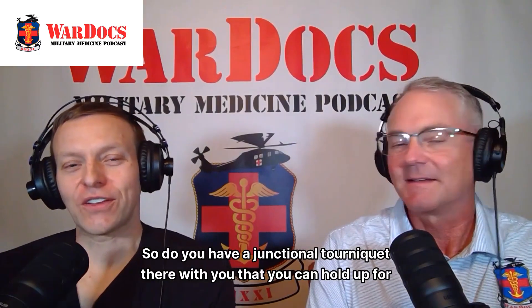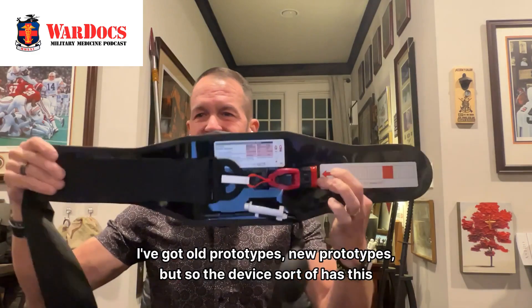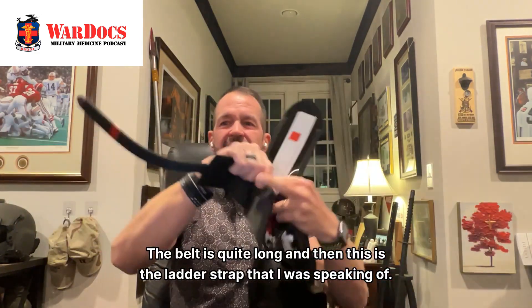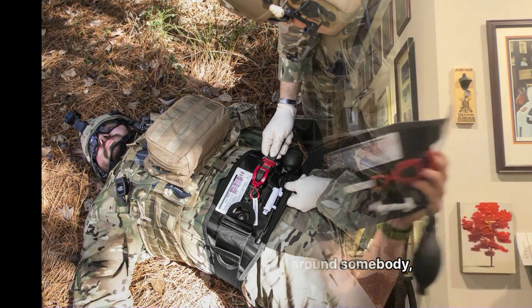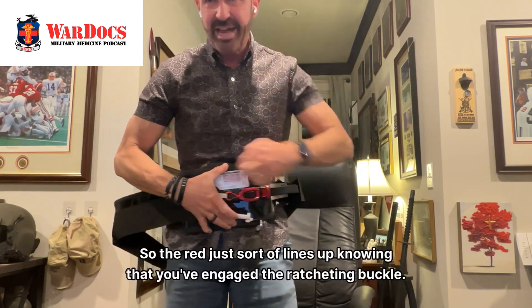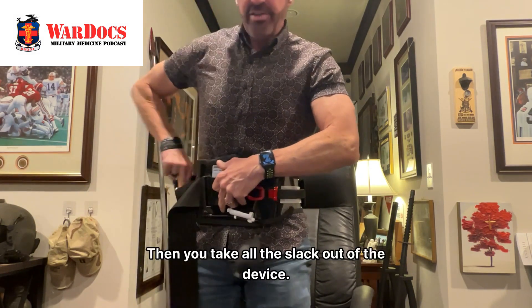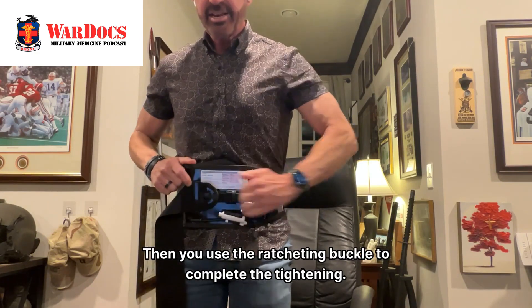The device has a cumberbund shape and the belt is quite long. This is the ladder strap, and when it's strapped around somebody — I'm just going to put it on real quick so you can see how this works. Red to red, so the red just lines up, knowing that you've engaged the ratcheting buckle. Then you take all the slack out of the device and use the ratcheting buckle to complete the tightening.